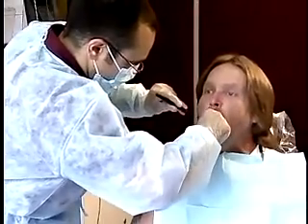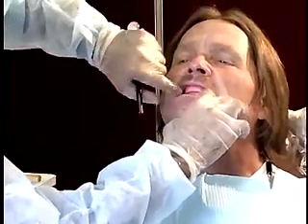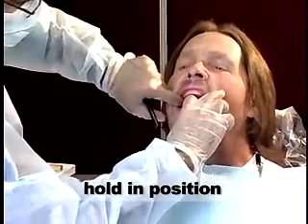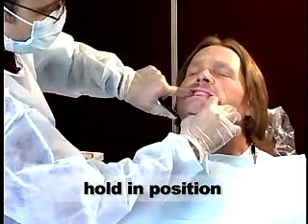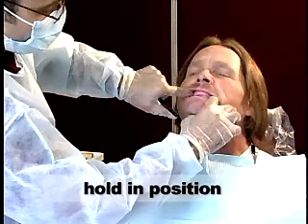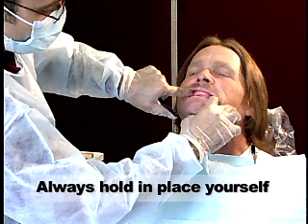Carefully place the record base in the patient's mouth and slowly guide the patient into centric relation. Hold the mandibular record base in position with your index fingers when guiding the patient into centric relation. Wait for the material to set according to the manufacturer recommendations. Always hold the record in place yourself.